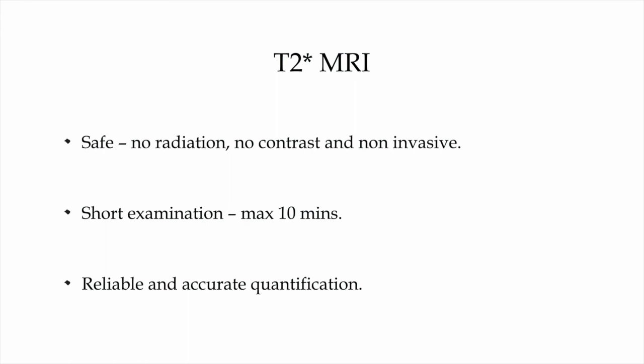So in summary, T2 star MRI is a very safe technique. There is no radiation involved, no contrast involved. It's a non-invasive technique. Very short examination, a maximum of 10 minutes. So we can do it in pediatrics also. It gives a reliable and accurate quantification of iron overload in the particular tissue.